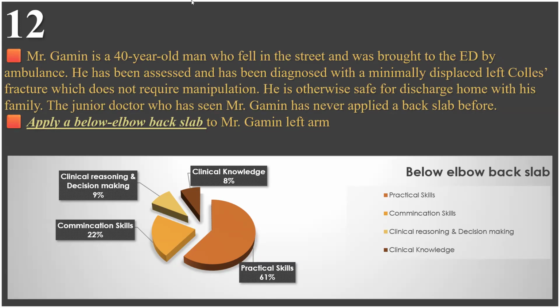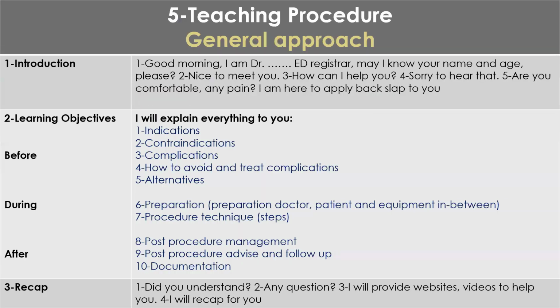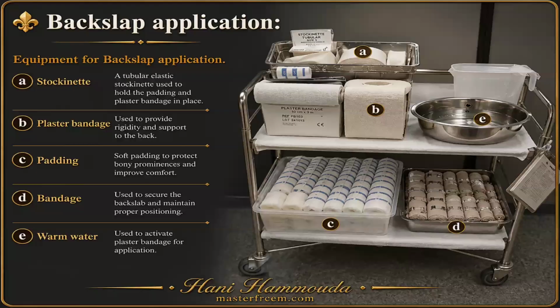Okay. Hello, my name is Dr. Omnia, emergency medicine registrar. Can I confirm your name and level, please? Hello. I believe we are having a patient for a below elbow back slab. So please, nurse, prepare stockinette, plaster bandage, padding, crepe bandage, and warm water. And make the patient sit in a chair.